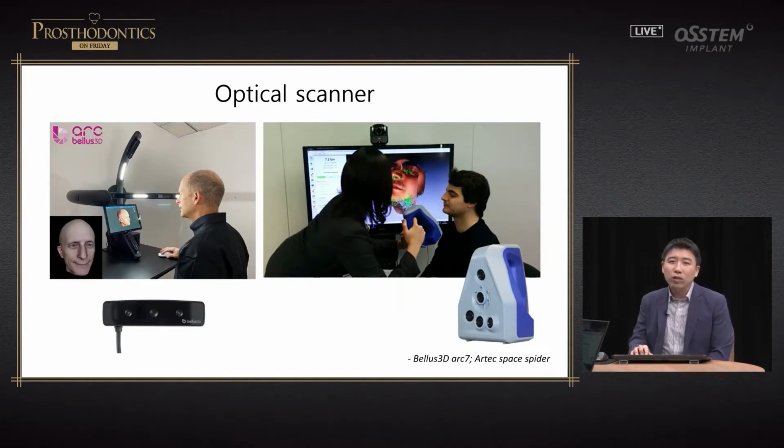What is most frequently used is the optical scanner. The equipment that you see is the equipment that we have at my dental clinic.